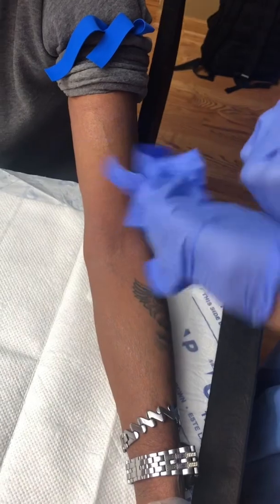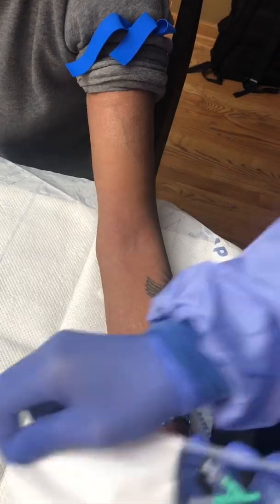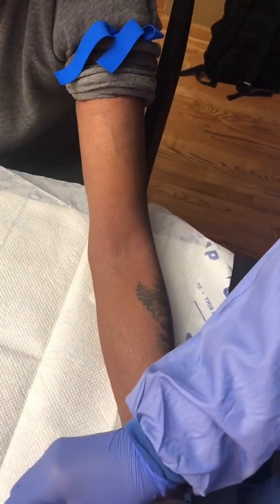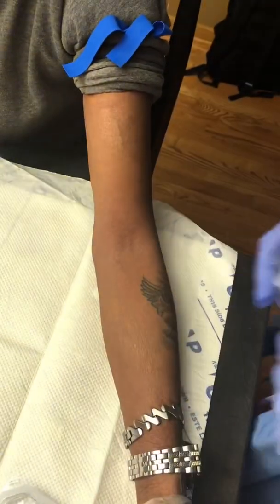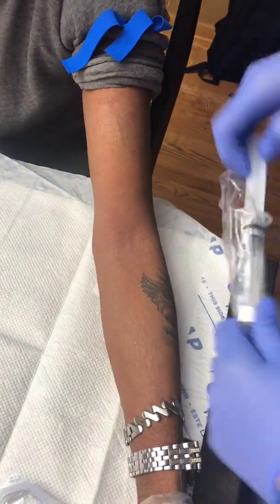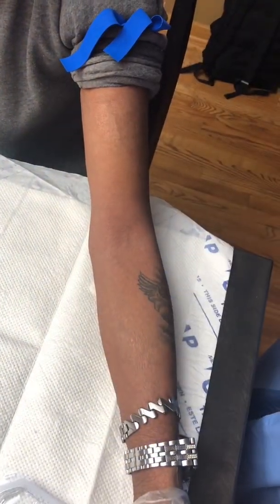Once you've assessed the veins with clean hands, it's time to put on your gloves. Notice how my body is aligned with the vein that I plan on inserting the needle into. You also want to have your flush ready to go.